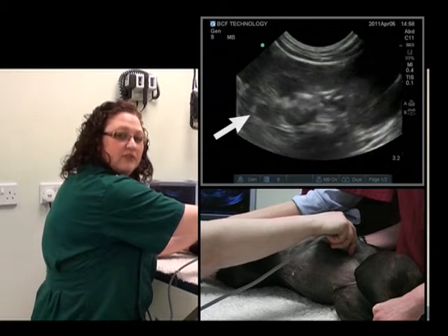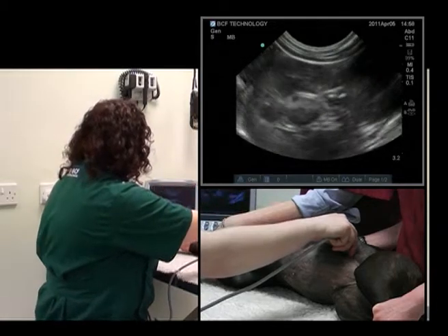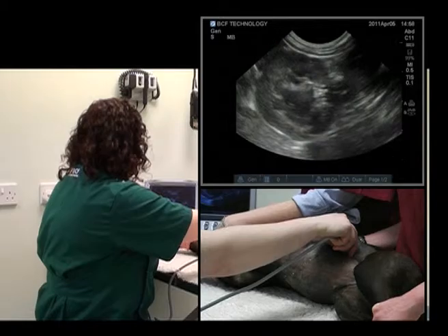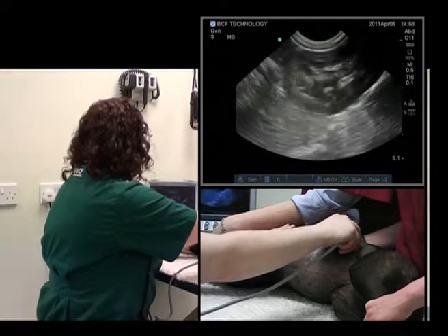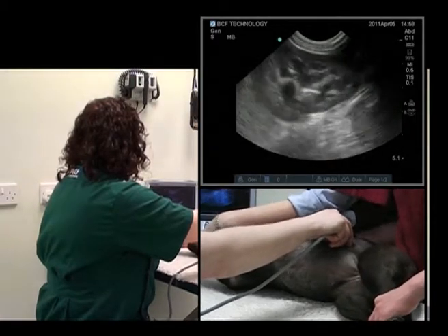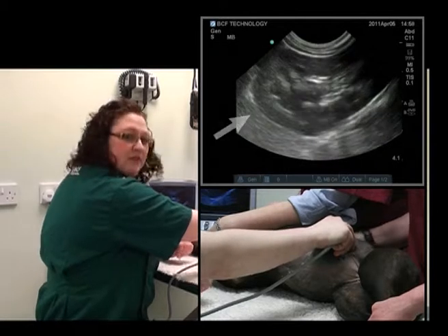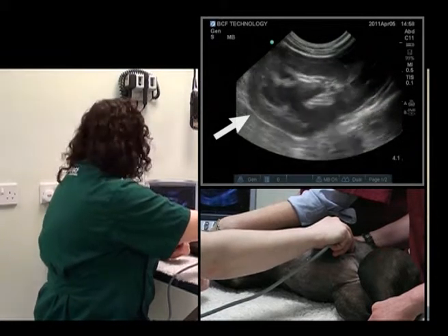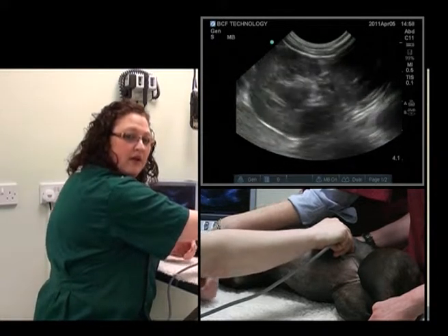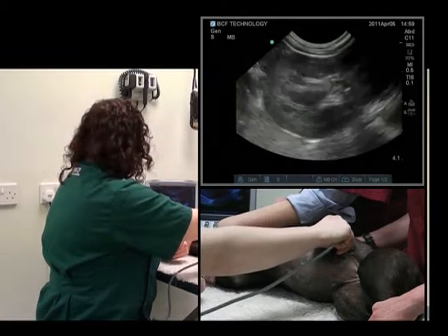Now we'll need to adjust gain, time gain compensation, and depth appropriately. And there the kidney is taking up about 3/4 of the screen. What we can then do is fan up and down to view it in a longitudinal section.